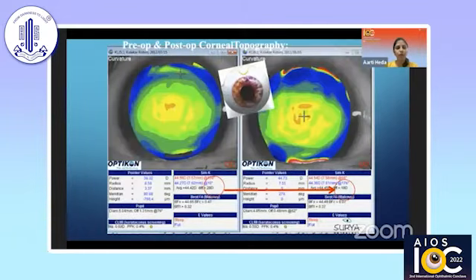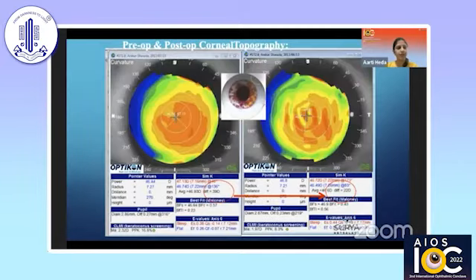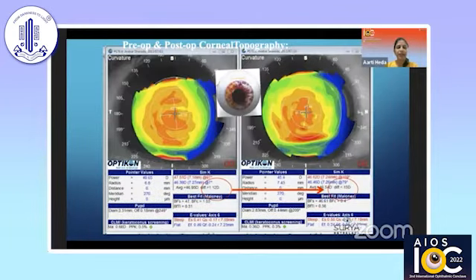We will go through a few more cases. This patient had preoperative astigmatism of 0.28 diopter and the steep meridian is at 100. The incision was taken at 100 degrees and it was extremely curved, so there was hardly any change in the astigmatism. In this case, the left eye, the steep axis is at 40 degrees. The incision was slightly curved, taken at the superotemporal axis, and it had hardly changed the astigmatism. Next is a case where the astigmatism is 1 diopter and the axis is at 90. The incision was taken straight, 6 mm, and it had reduced the astigmatism.